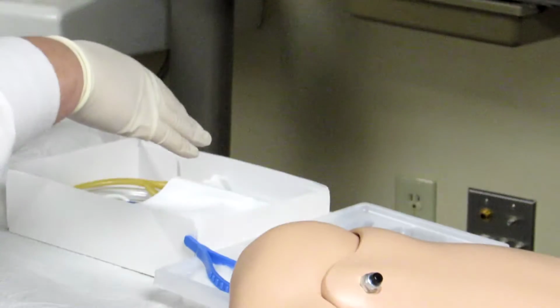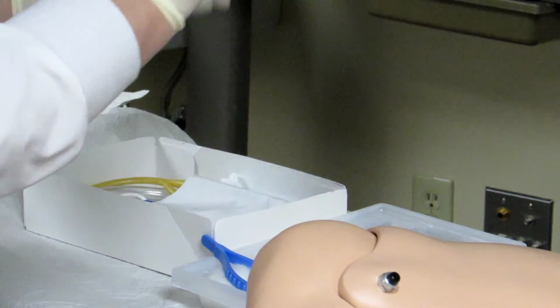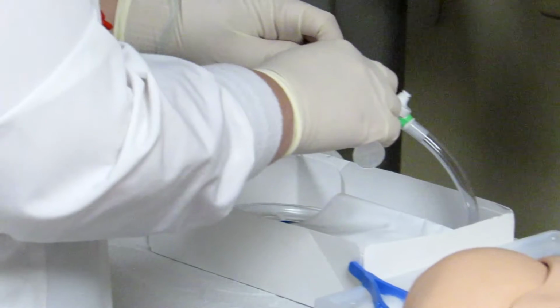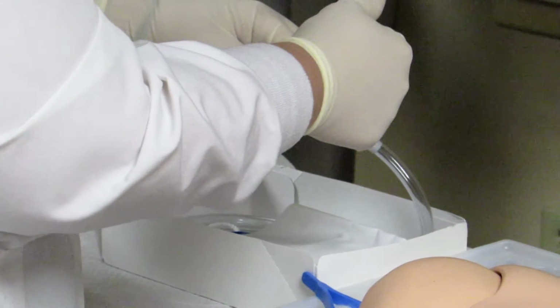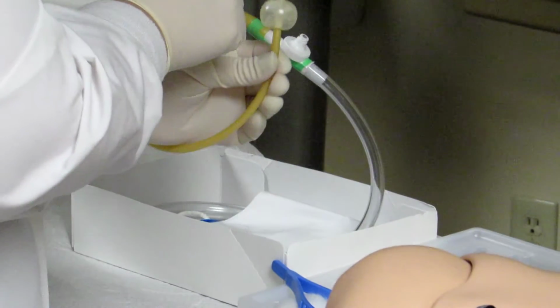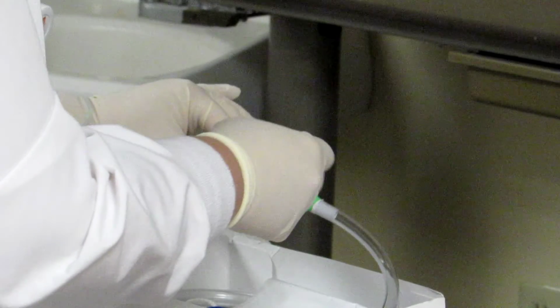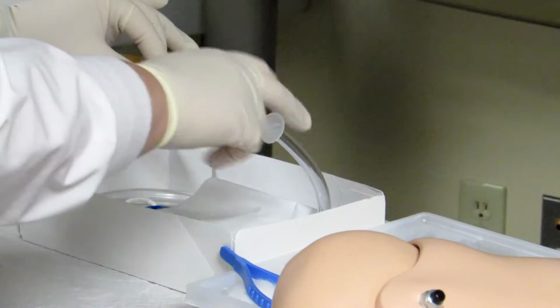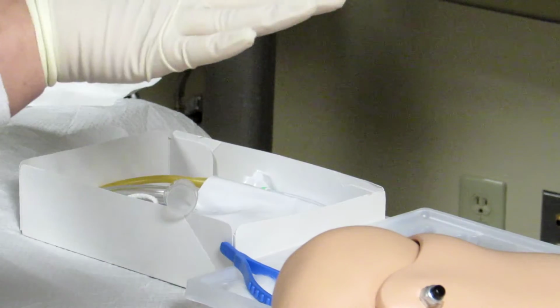Everything in there is sterile. I want to check my balloon, so I'm going to get my 10 ml syringe here that's filled with sterile water. Hook it up to this port right here, and I can again check my balloon here, like I showed you in the video. Make sure that it's not leaking and that it's inflating properly. And I'm going to deflate the balloon and leave my syringe completely attached right here so that it's ready for me when I go to insert this on my patient. So now I'm ready to move everything to the bedside.